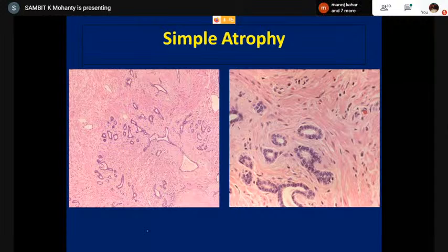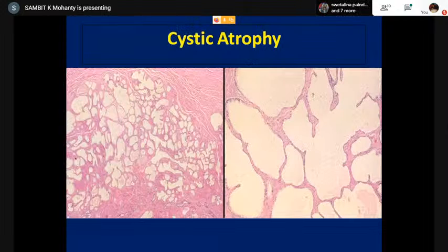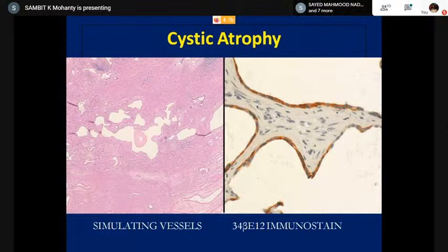And you can have some inflammatory infiltrate, like in any elderly man's prostate, you see some lymphocytic infiltrate that doesn't make it lymphocytic prostatitis. And you can have these microcystic kinds of spaces. This is not hyperplasia because there's no hyperplastic change, no infolding, outpouching, papillation, or tufting of the lining. So they're again atrophic with cystic dilatation. And here is the high molecular weight cytokeratin, just to say it is present. And with atrophy, remember, first the acinar cells undergo atrophy, then the basal cells.